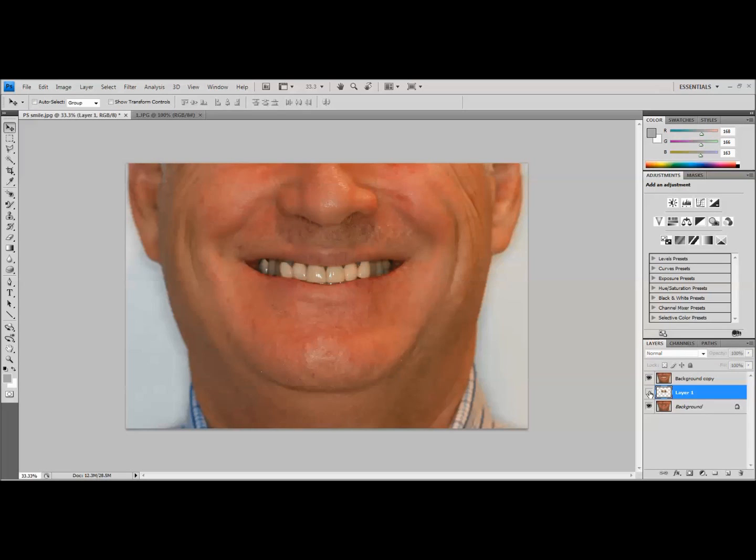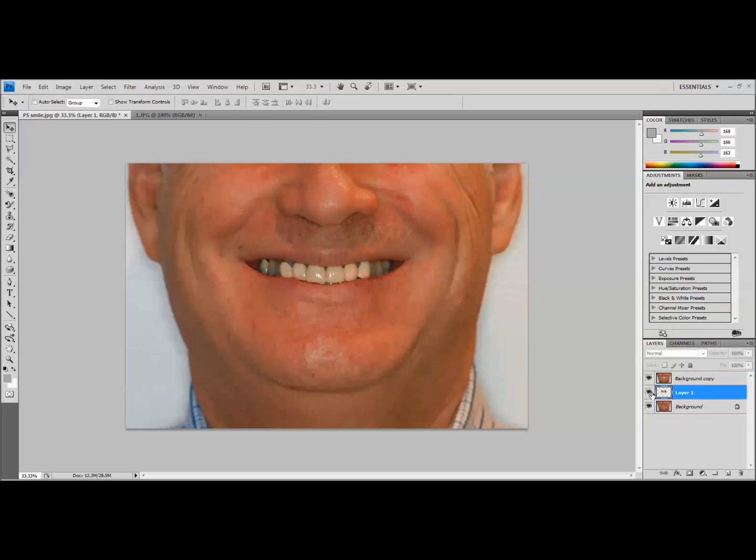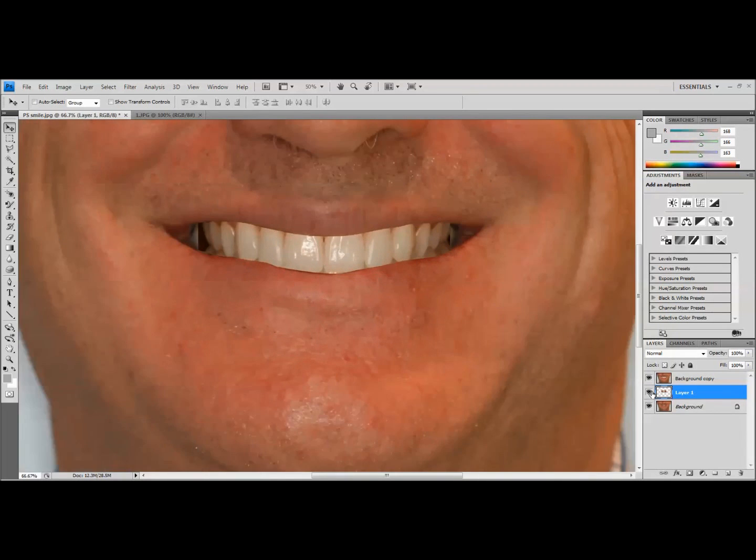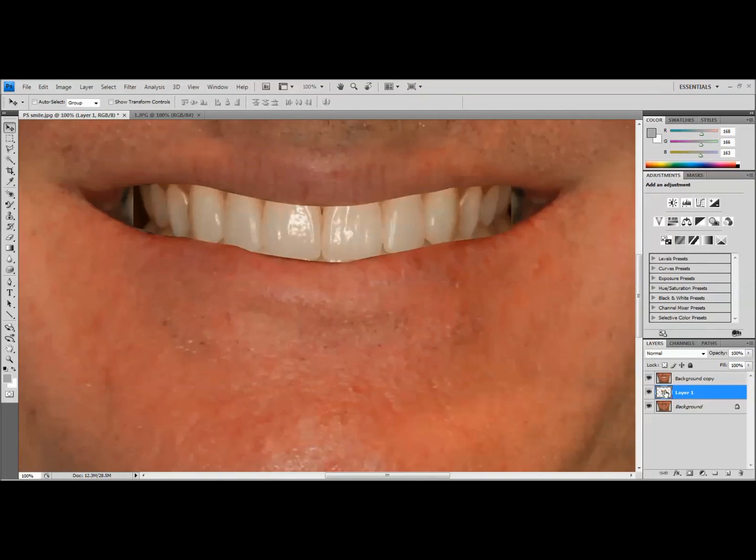Now a few things that jump out at me, if you focus on the first molar region on both sides, our simulation is a bit narrower of an arch. Again, if you're just trying to start the conversation, that may not be critical, but if you're wanting to use this for lab communication and for truly designing the smile before you start wax ups, that might be important to fix. And so let's zoom back in and make a few of those changes.